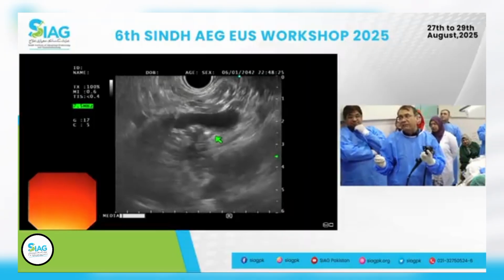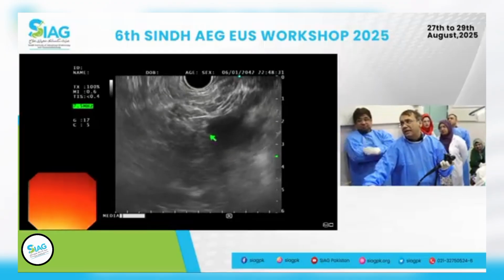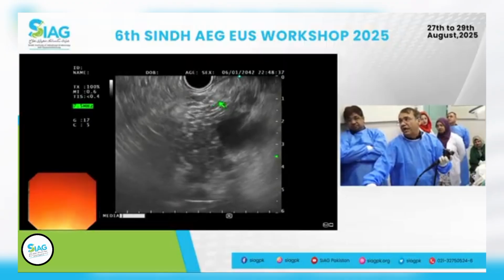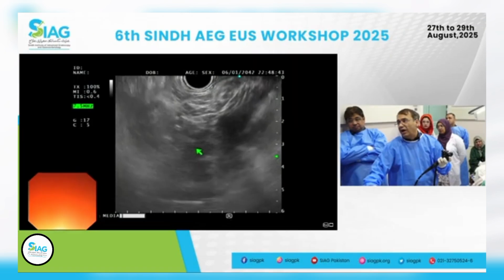From the stomach, basically we're able to see here the SMV, we saw the splenic, we saw the portal, we saw the bile duct earlier, we see a mass in the head of the pancreas. So your neck is basically falling right there. This is the neck area because the confluence is right here. So the duct should be falling all around here.